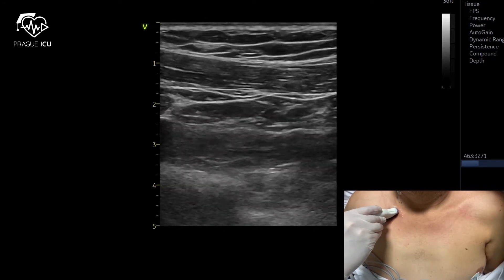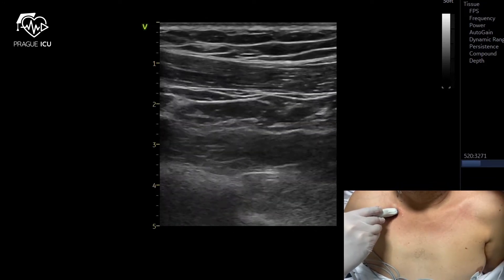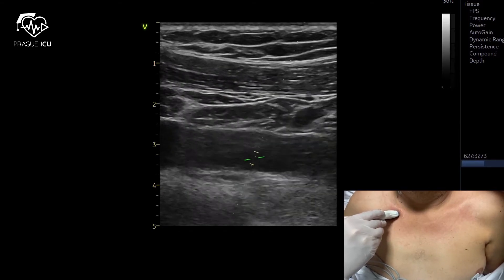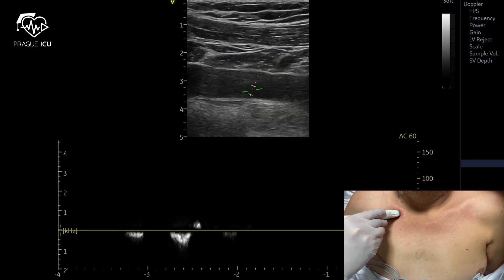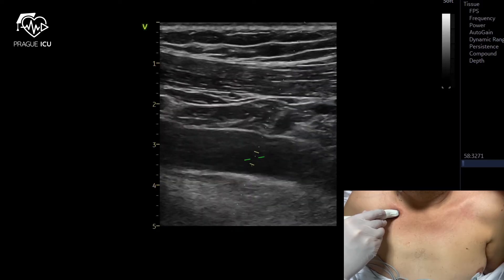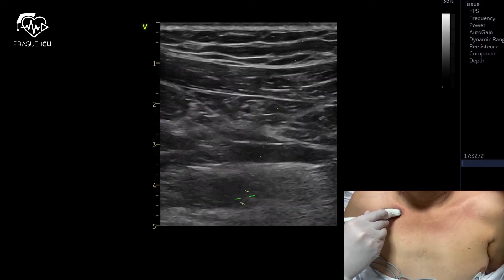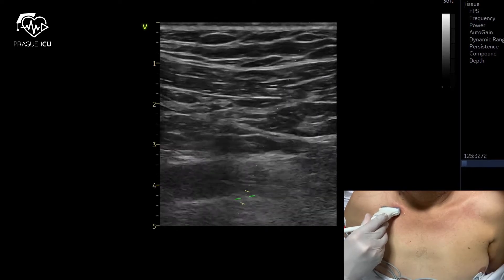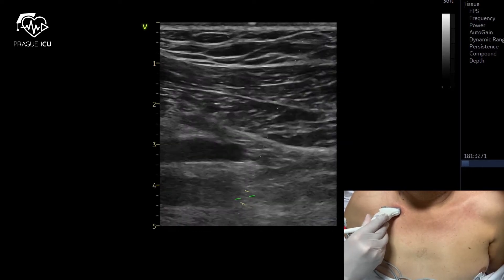When rotating the ultrasound probe clockwise, you will get the longitudinal view image of the vein. The vein is easily compressible and pulse Doppler shows low amplitude waveforms. By tilting the probe down, you will be able to see the subclavian artery, which is posterior and superior from the vein.